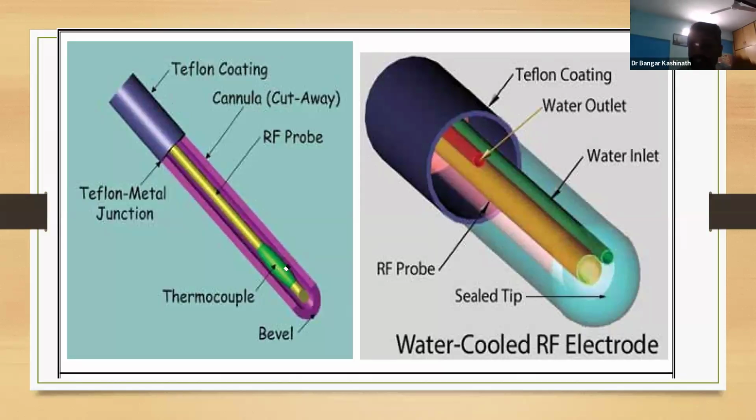Here, even if the temperature is increased, voltage increases, but the extra heat is carried away or dissipated via the water. And that's why the lesion size is bigger. Is that clear? Yes, sir. Fantastic.